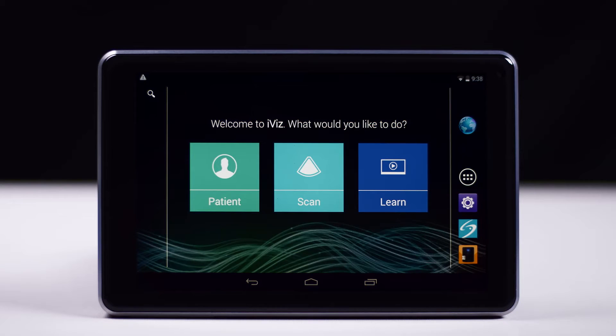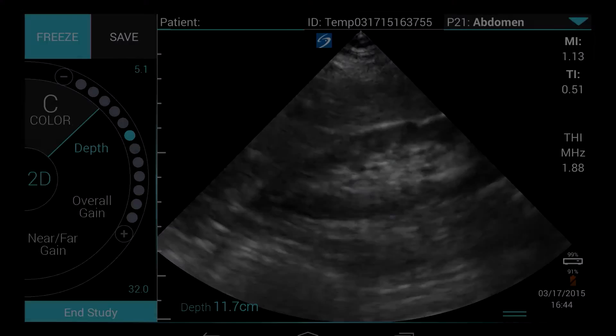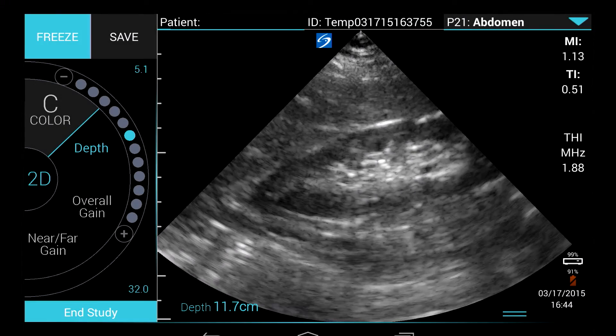Welcome to the help video, Taking Measurements. In this video, we will walk you through how to take a general measurement with your iViz ultrasound system.